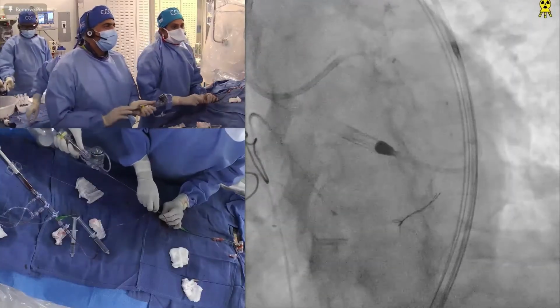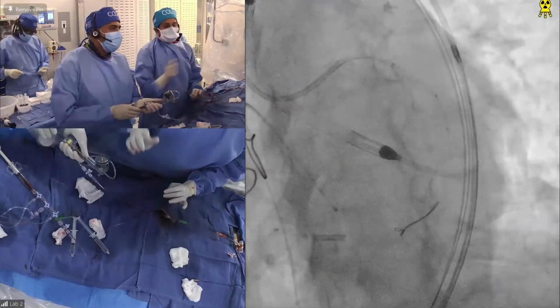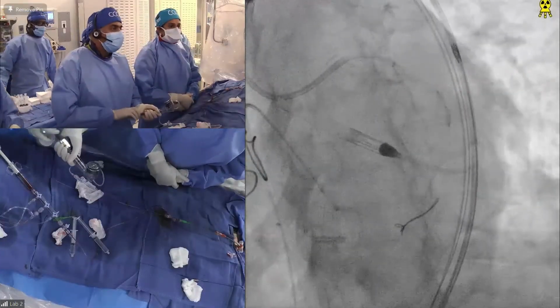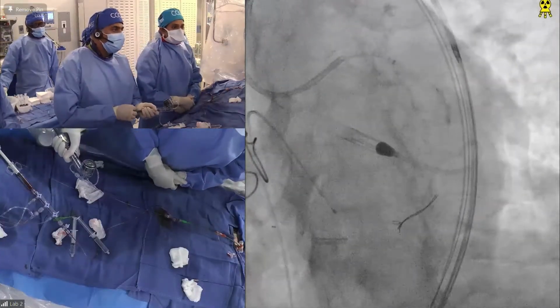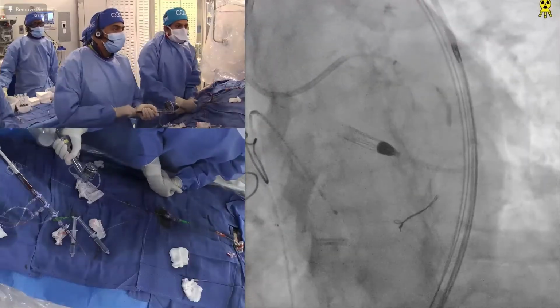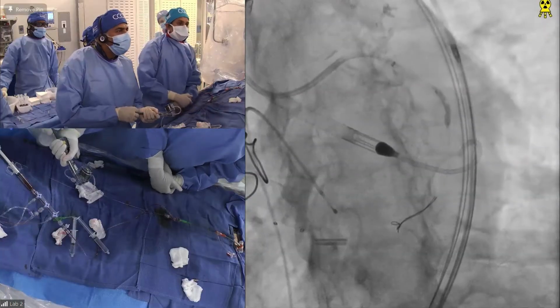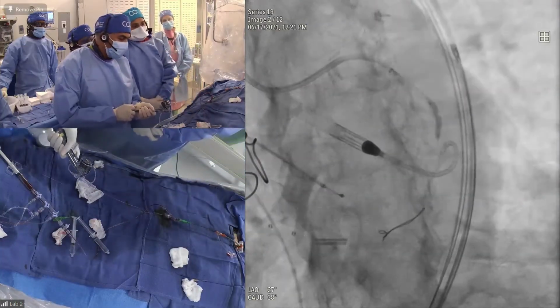The rotor wire will not go. Oh, no, here you go. I mean, the burr went through now. Yeah, went in now. We may even rupture. Yeah. Want to send in or? So it seems like that needed a little bit of atherectomy as well.